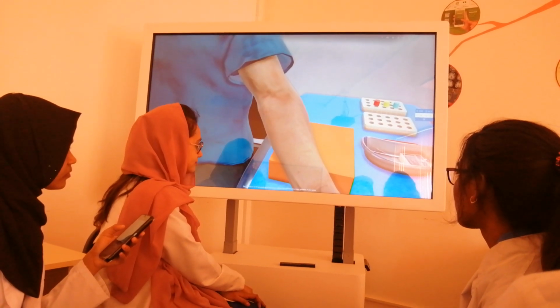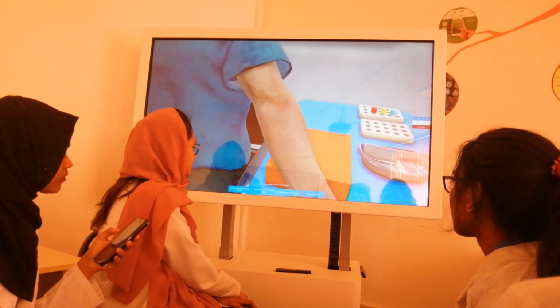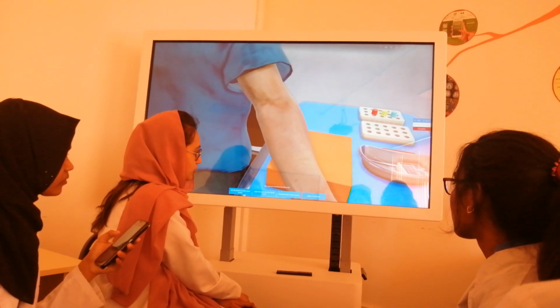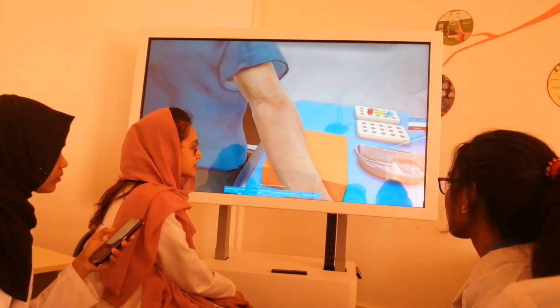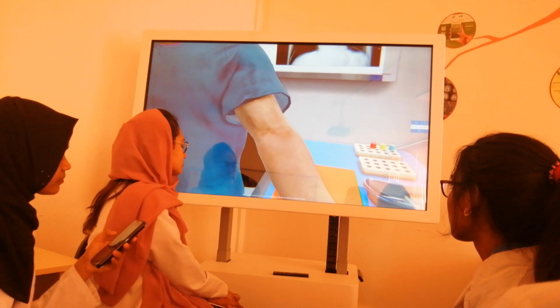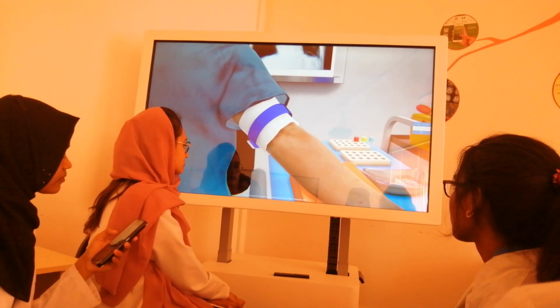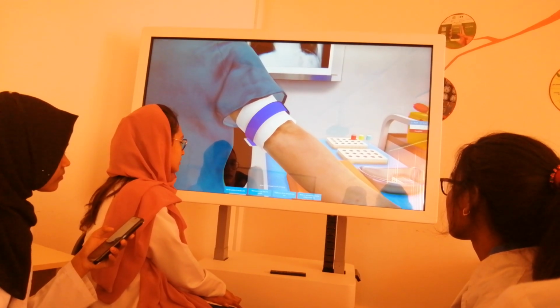Presence of skin rashes. What process should be the following? Ask the patient to take a deep breath. Insert the tube into the needle holder. Assembling the vacuum system. Apply a tourniquet. Place a tourniquet 10 to 15 centimeters above the intended puncture site on a sleeve or disposable napkin. What process should be the following?